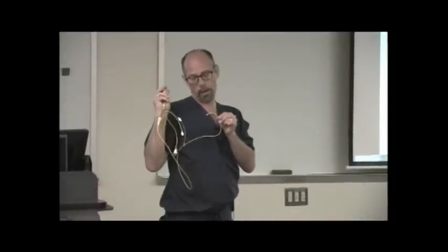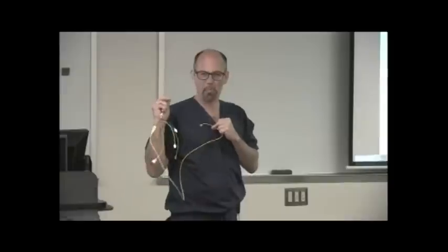Because if I inflate this balloon when the tip of the catheter is in the pulmonary artery, I'm inflating the balloon against the wall of the pulmonary artery. What do you think could possibly happen when I do that? I can rupture the pulmonary artery, and you better believe it. So we don't do that so much anymore. All right? Once it's in, we leave the balloon deflated.